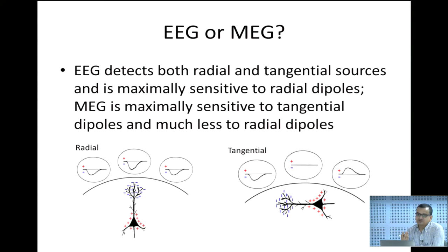If you take all this out, you see that EEG can see both and MEG can see only one. That could also be one reason why MEG took quite a long time before being accepted by the community. You think, why should I spend a fortune on a system which can only give me a fraction of the information? If you have limited resources, there is little point. There are still some classic people from the electroencephalography community who do not accept MEG. They think there's no point in investing so much money. But it gives certain benefits.